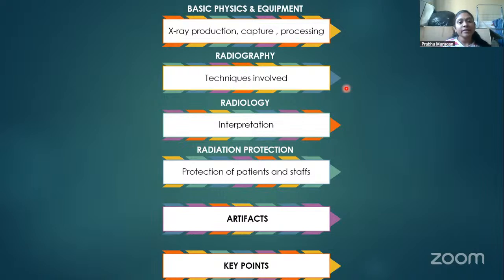Next, after taking the X-ray, we have to interpret it, right? Basically, it is just for diagnosis of any kind of lesions. So we have to know what is normal to differentiate it from pathologies. So interpretation is very important.